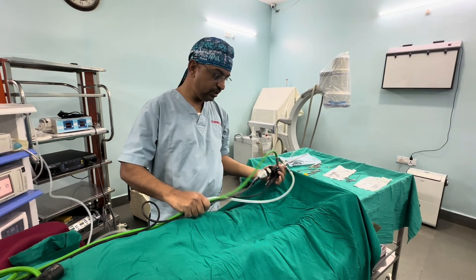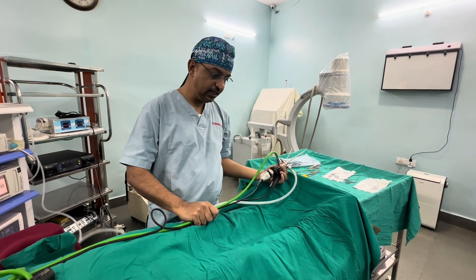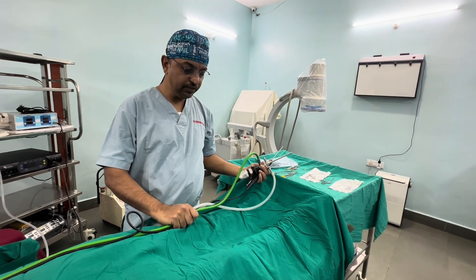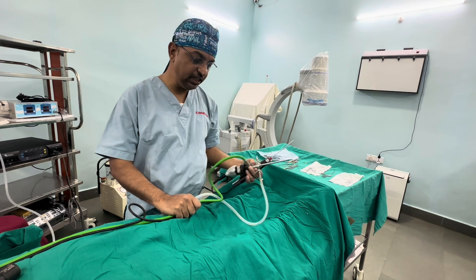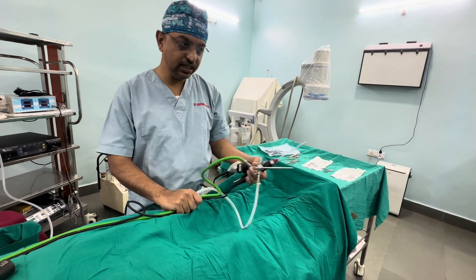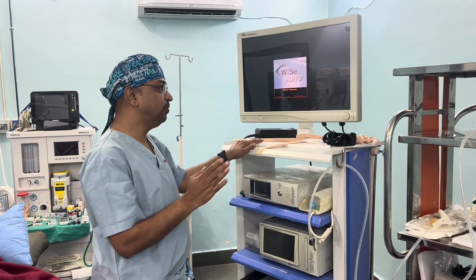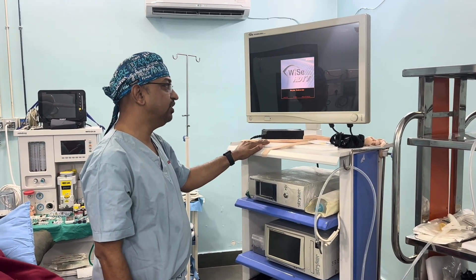An important thing to note is that our cable should be at least foot length so that it does not hamper our dexterity and we are able to operate freely in and around the knee. We have kept it opposite to the side of the limb that we are operating.